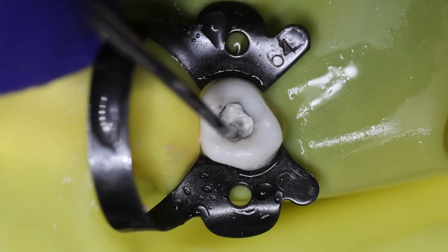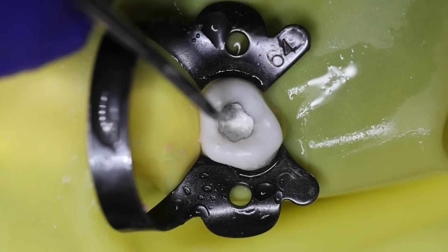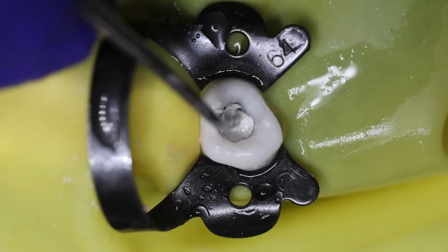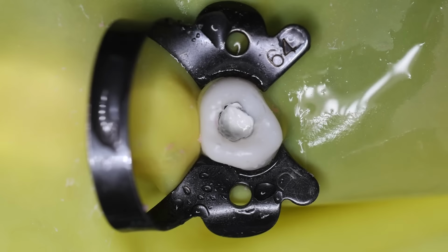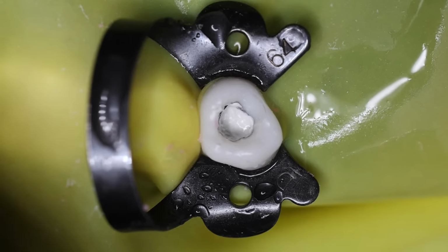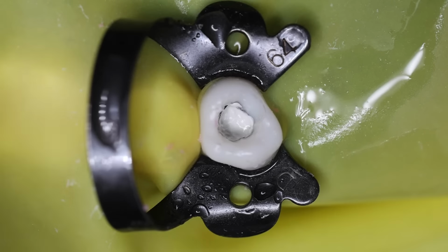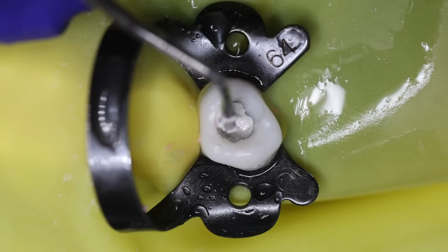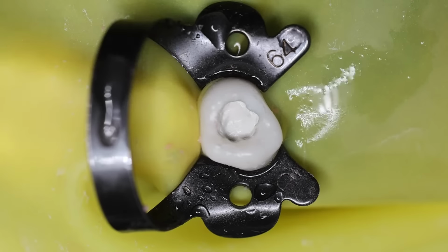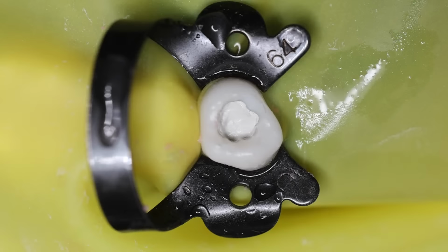This will be like 2 mm of increment that we are placing. Again we can take a little bit more. Remove any excess if there is.